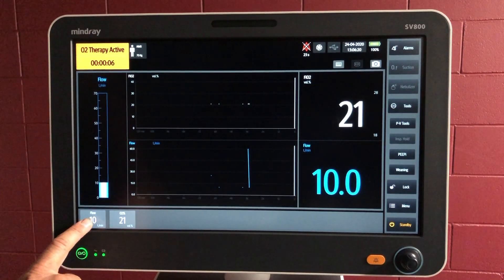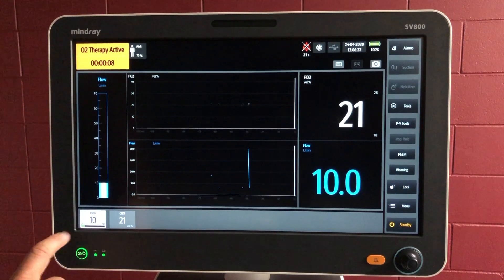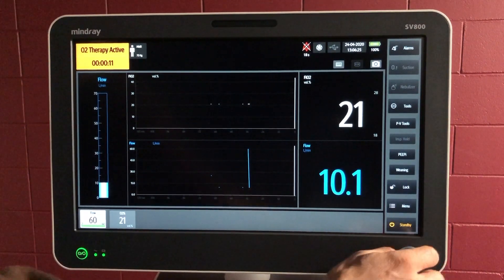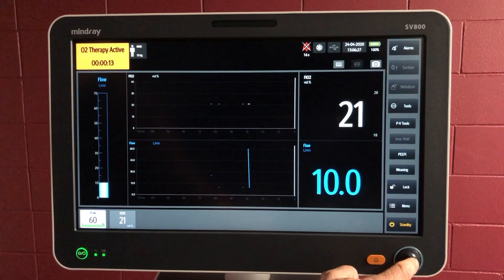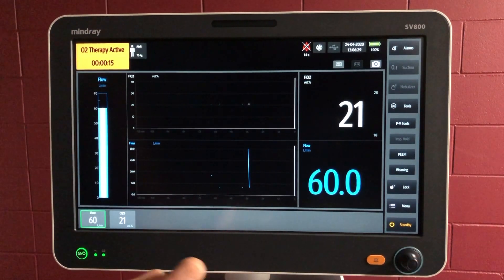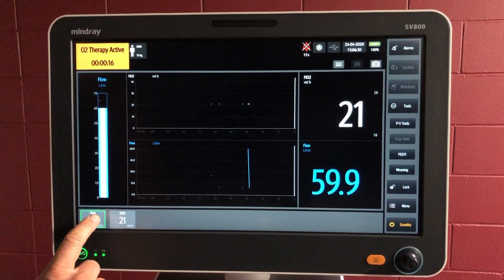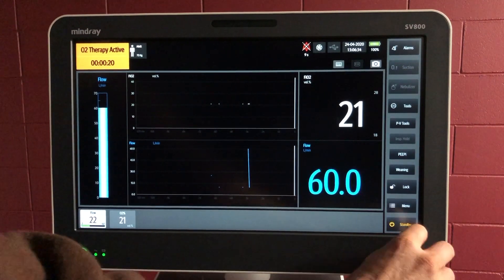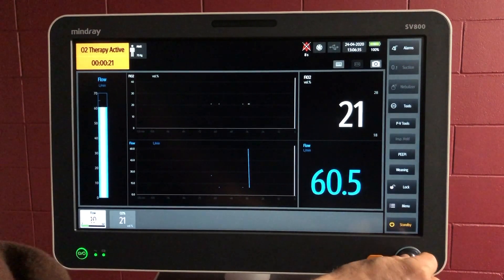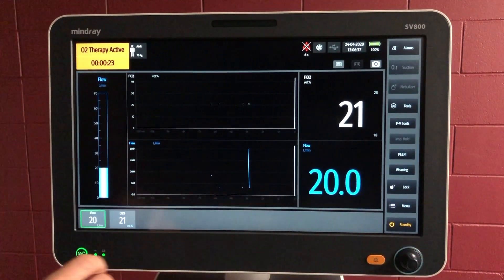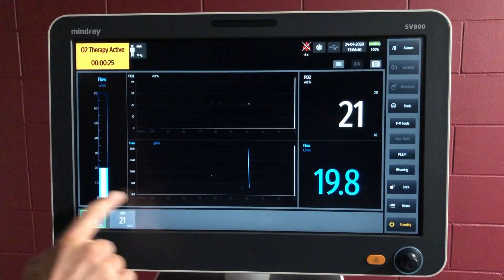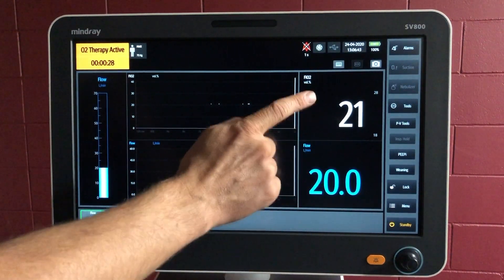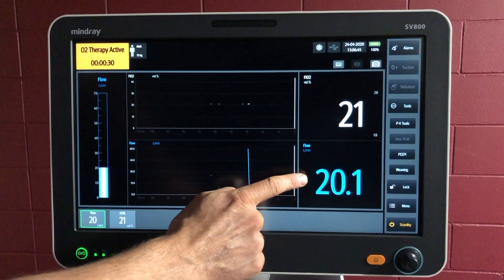So let's go with flow — we can adjust that. Just select the parameter, adjust the parameter up to 60 litres per minute, and then confirm with that button as well. We select the parameter, adjust the parameter, and confirm that. We'll have settings here, and the readings are here according to the oxygen sensor and the flow sensor.